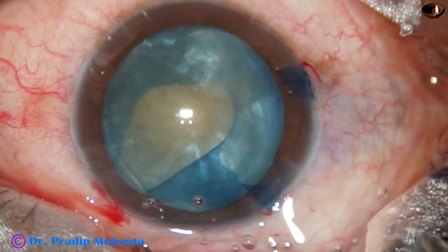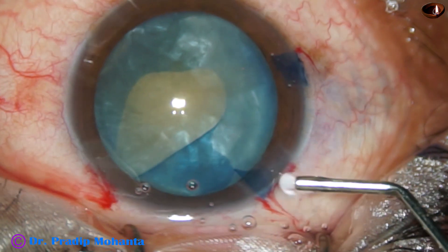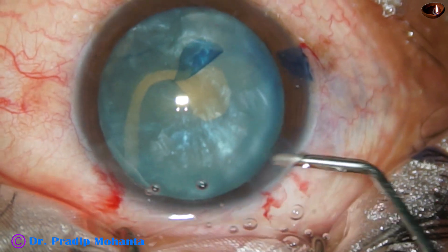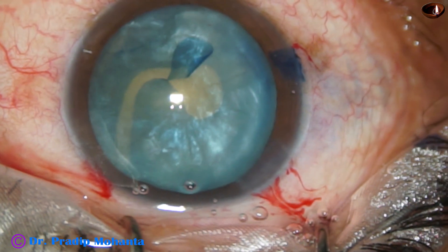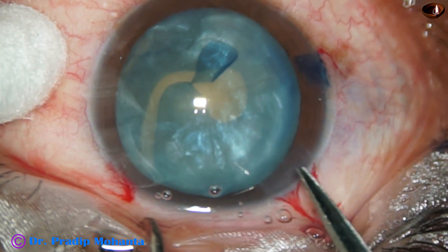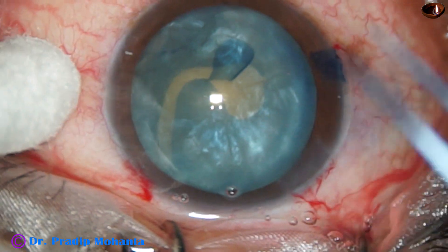Whatever has happened has happened. Now we have to manage the case from here. We have two options: either we can convert to SICS or we can proceed with phaco. As I see that this nucleus is not hard — it is a Grade 3 nuclear sclerosis — I proceed with phaco.